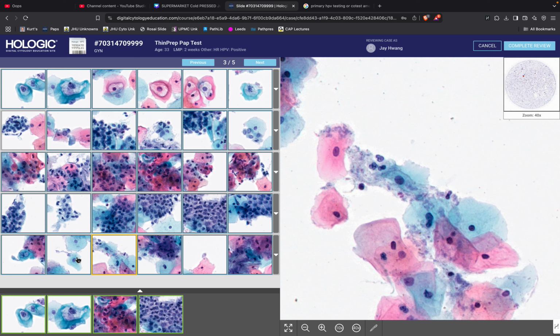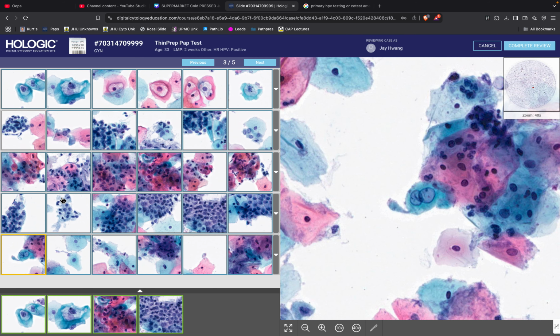So yeah, this was a good case, a very good case, I would have to argue, of LSIL.